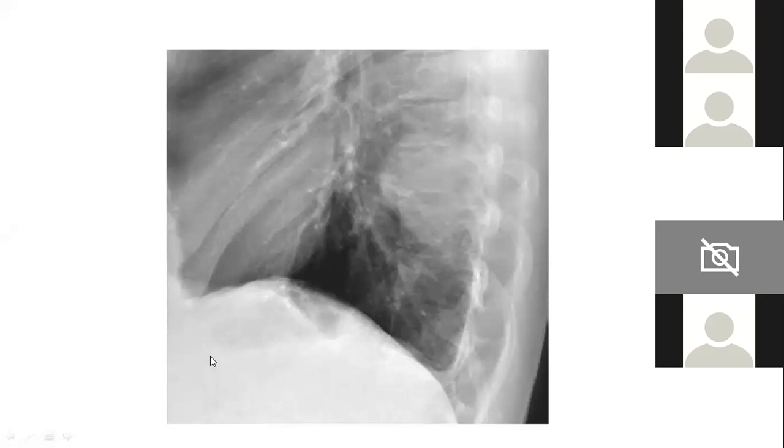Someone is asking whether we can comment directly on posterior or middle and anterior mediastinum from the frontal view. I personally feel you should, if possible. There is no fun if you just say mediastinal mass and leave it, right? So we need to investigate a little bit more. If you can get those subtle signs which indicate a particular mediastinum, then why not go for it? You can always confirm with a CT. It's all a learning experience. If we don't know how to comment, then it becomes a problem.